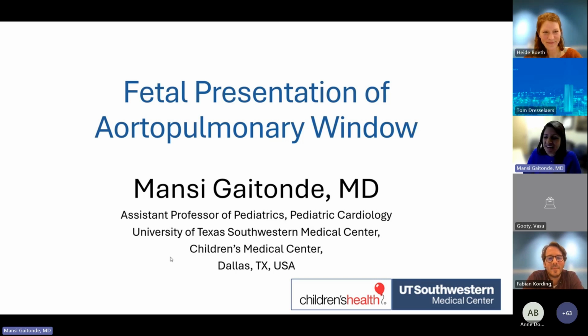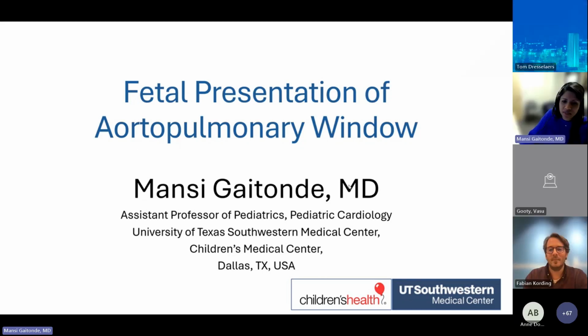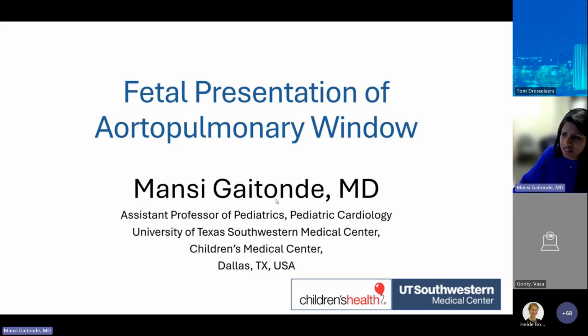All right, so I'm Mansi Gaitonde. I'm one of the pediatric cardiologists at UT Southwestern in Dallas, Texas. So I'm going to go through this case on fetal aortopulmonary window. The reason I picked this case was not because the images are pretty. In fact, Heidi encouraged us to show some things that were challenging, but because I felt like we still made a clinical impact despite how difficult this was.